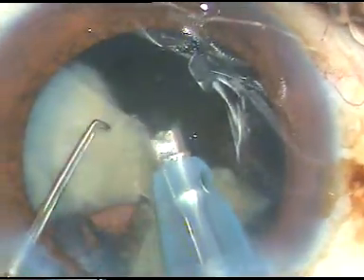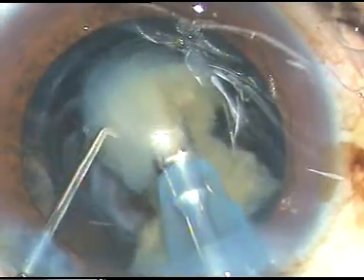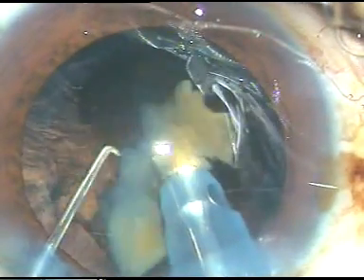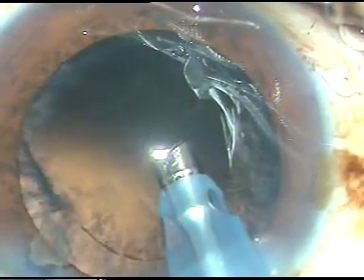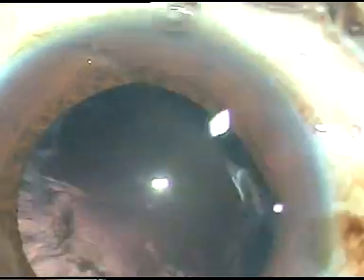This is the last fragment. I remove the chopper. The posterior capsule goes towards the vitreous cavity and it becomes very safe to remove the last fragment.